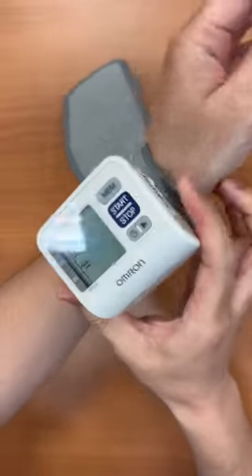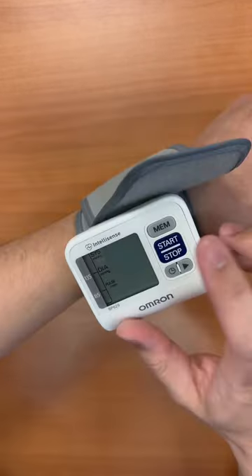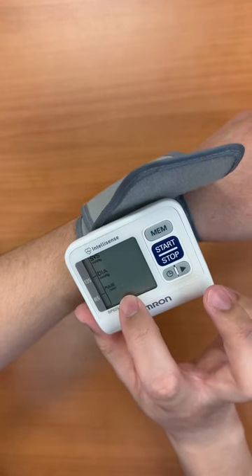If it's on the left-hand side, the screen should go on the thumb side, and then you have the patient cross their arm across their chest. Then press this button to get the blood pressure as well as the pulse.